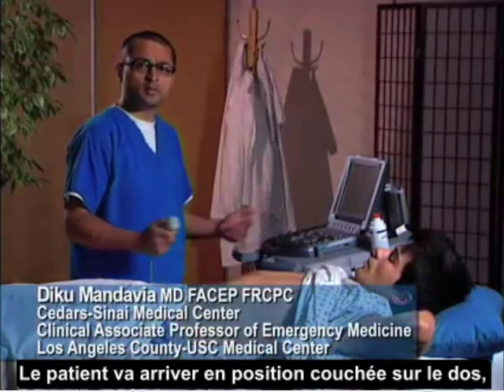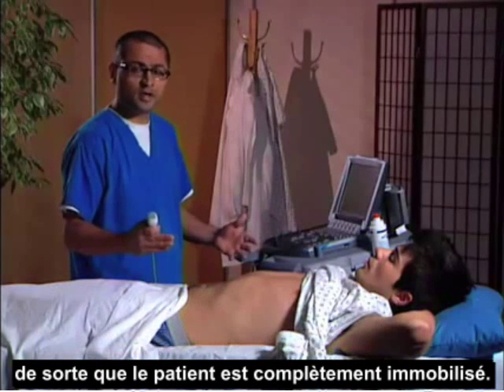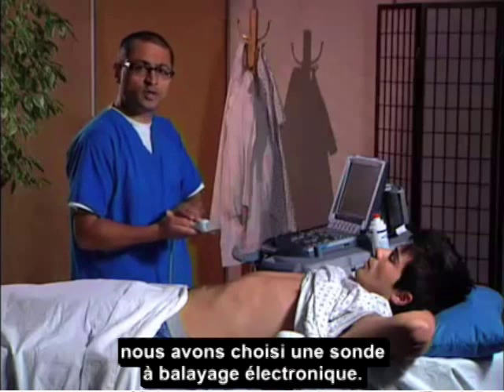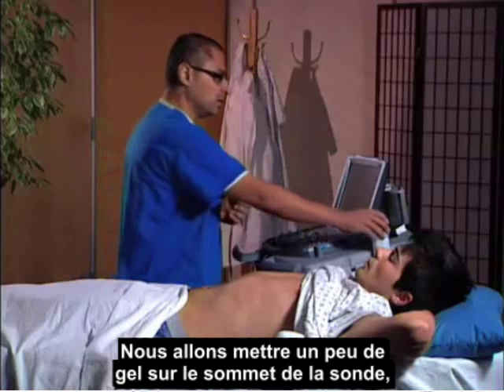The patient is going to arrive in a supine position, often on a backboard with full spinal precautions, so motion of the patient will be impossible. We're going to choose our transducer — we have chosen the phased array transducer — and we're going to put a little gel on top of it.